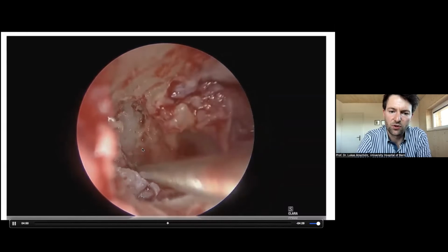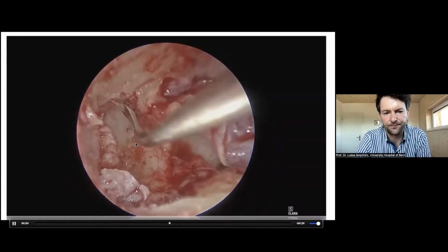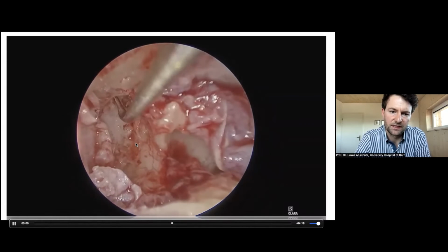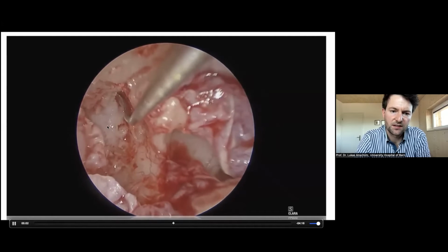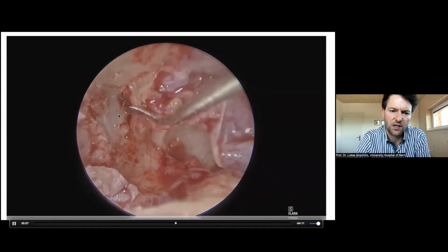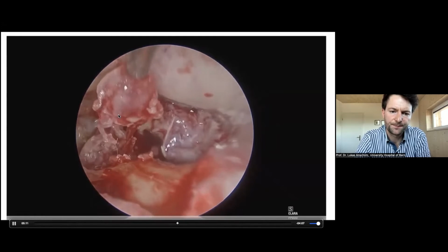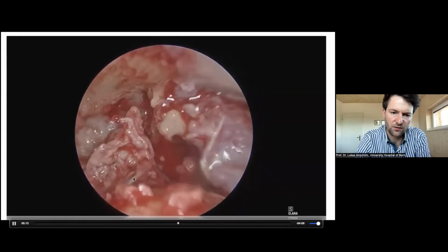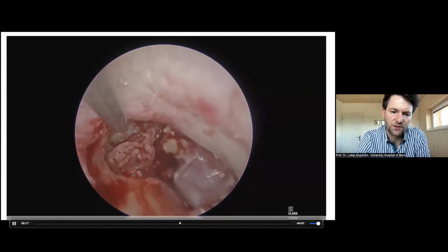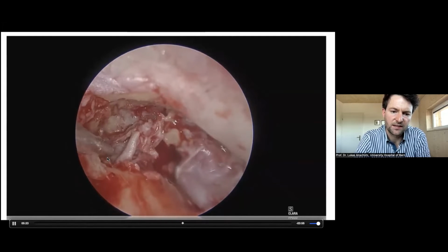It has this kind of dissector on both sides, and it is very well suited to clean the cholesteatoma from the side. And you can see again here, this is the tegmen tympani with a small dehiscence. I'm not sure if you can see it, but there was a small hole in the bone, and we do a little bit of debulking of the cholesteatoma, and then the cholesteatoma can be followed posteriorly. You can see it here, posteriorly into the antrum, and its extension into the mastoid.